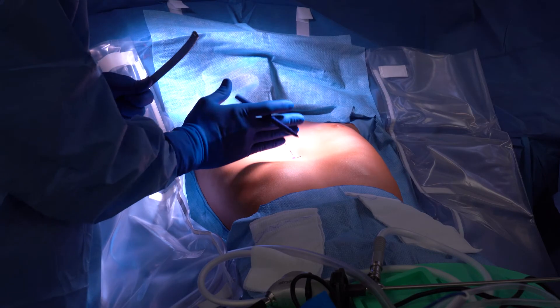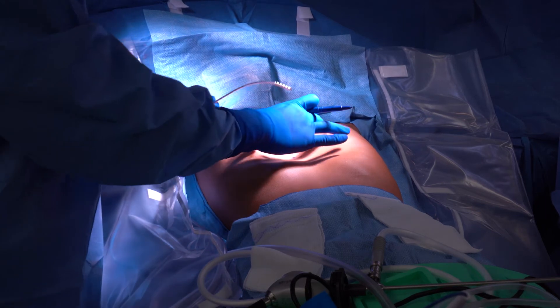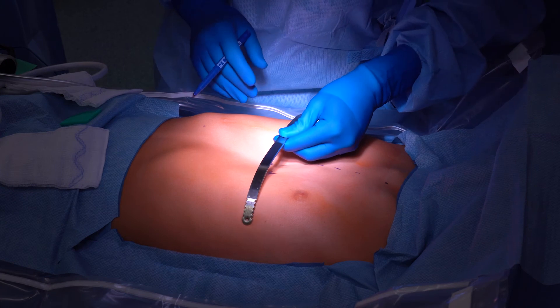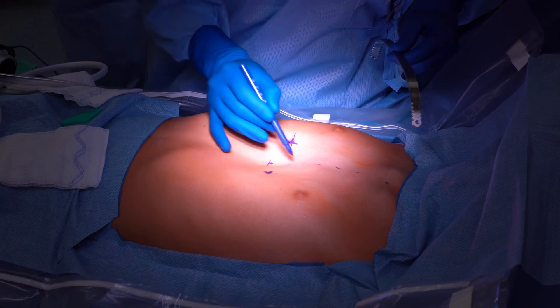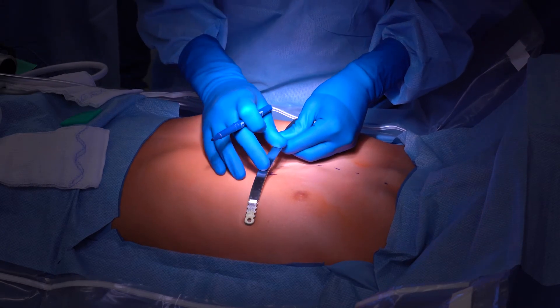The placement of the hardware allows us to reposition the ribs and costal cartilages where they belong, but the actual remodeling process is a healing process within the patient's body. Once the hardware has been in place, typically for three years, we will take the patient back to the operating room, open both surgical incisions, flatten the bars, and remove them from the scar capsule that they have been sealed in for the past three years.